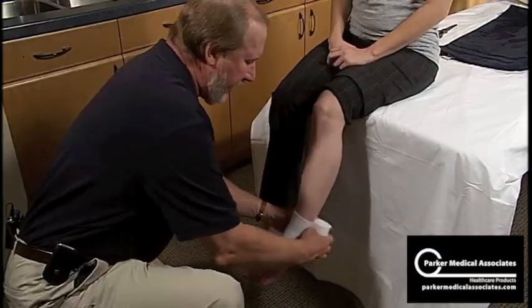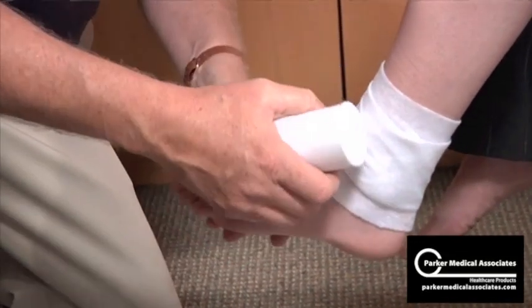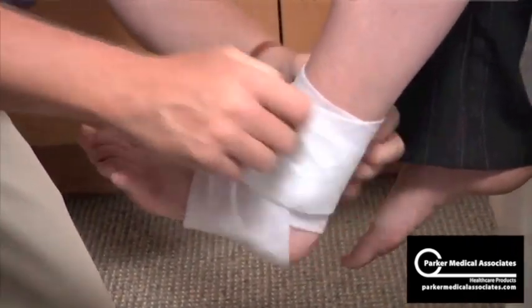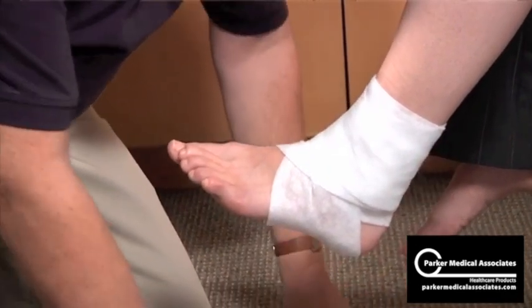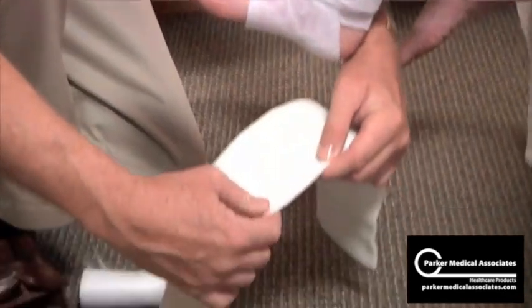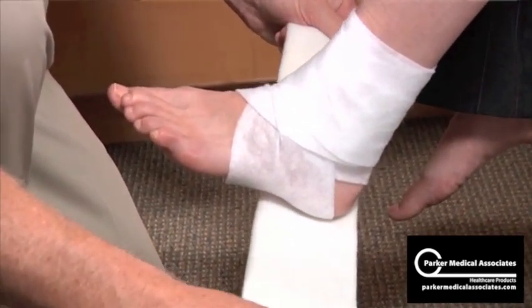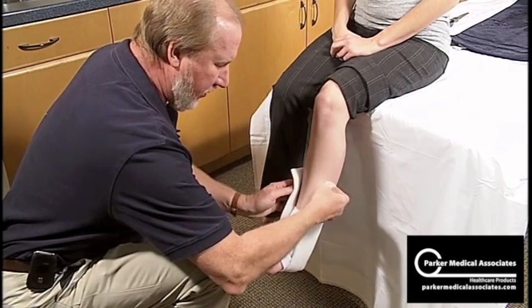Now I like to pad over the malleos here, loosely, just for a little bit more comfort. When I put those cuts, put them in the back of the heel so they're not digging in. And just place it on the bottom — she sits only on padding. Come up on both sides — your stirrup.